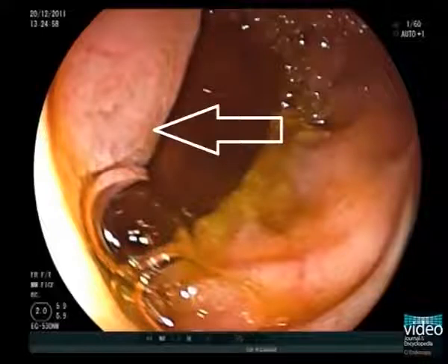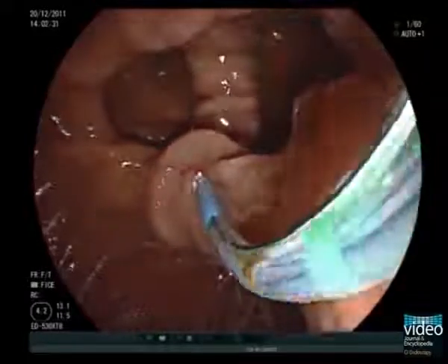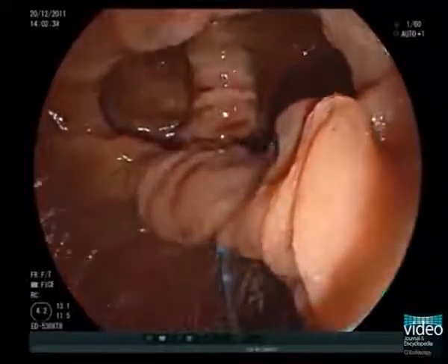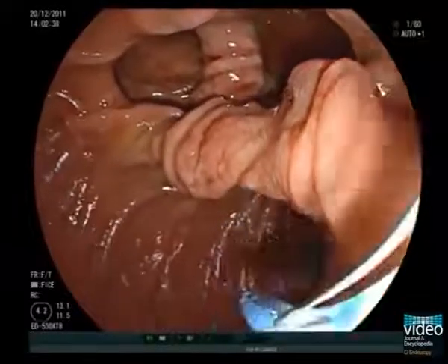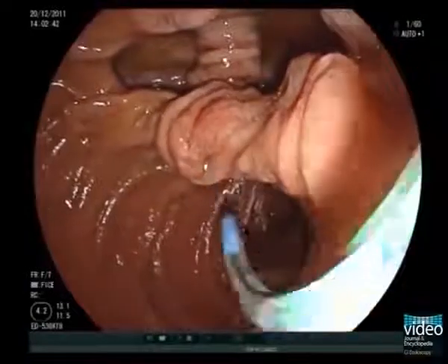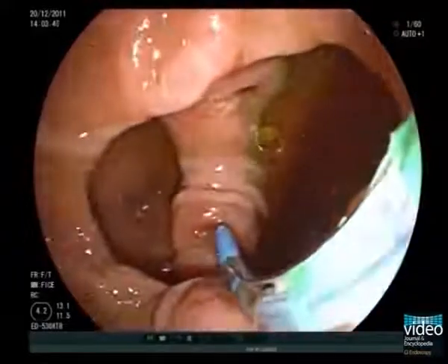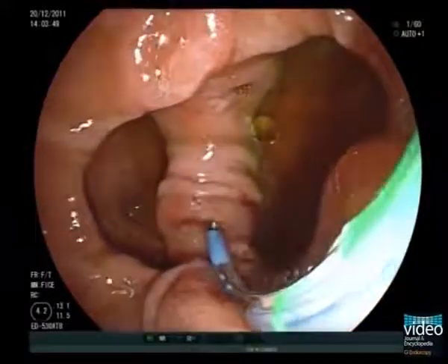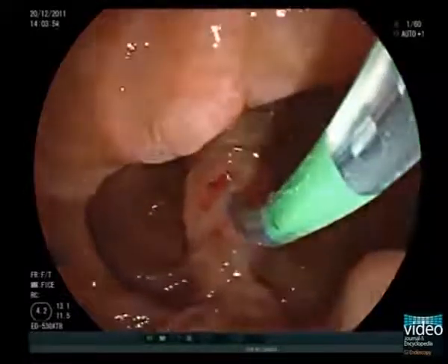Now we can proceed to wire-guided cannulation of the papilla with a sphincterotome. For optimal orientation of the sphincterotome, keep in mind two things. First, the septum of the diverticulum represents the orientation of the bile duct. Second, biliary direction within a periampullary diverticulum is mostly not as acutely angulated superiorly. Thus, it is not necessary to angulate the sphincterotome as acutely upwards.